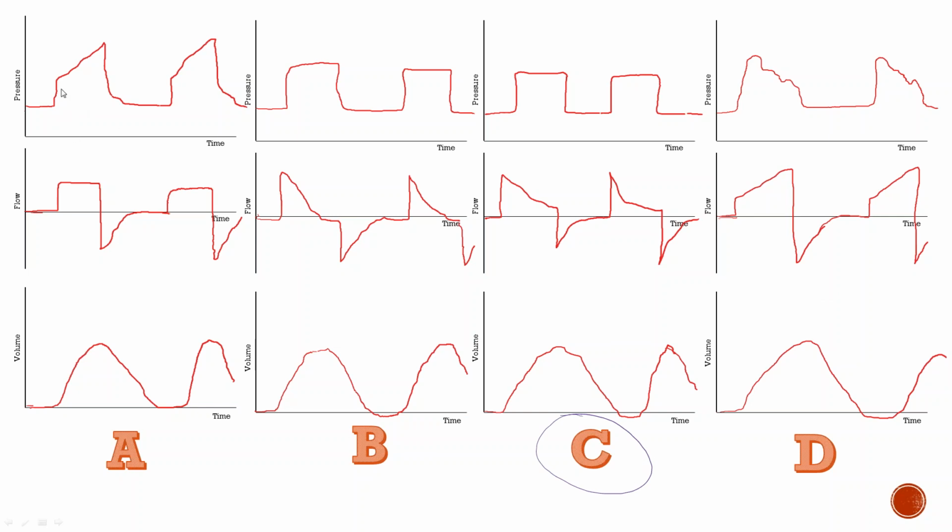So you missed the first part, Gargi, but basically the pressure scalar, if you have an ascending pressure scalar like this, then it is fairly specific for a volume control mode of ventilation, especially if the patient's breathing passively. So this is volume control. And this is the ICP waveform. I just threw that in there to mess with people.